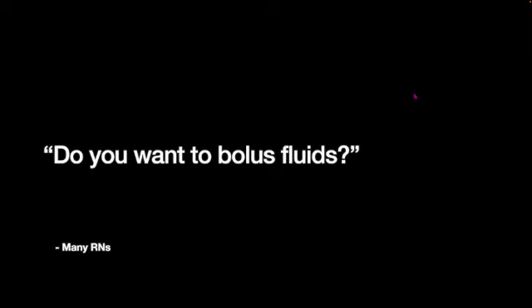Now, once you guys get a lot of experience under your belt, you are definitely able to perform a DVT ultrasound at the bedside. Believe it or not, this is actually a rather easy evaluation that we do all the time in the emergency department. I don't think we're going to be able to teach you this on our hands-on day, but I will let you know that it is absolutely something you are quite capable of performing.